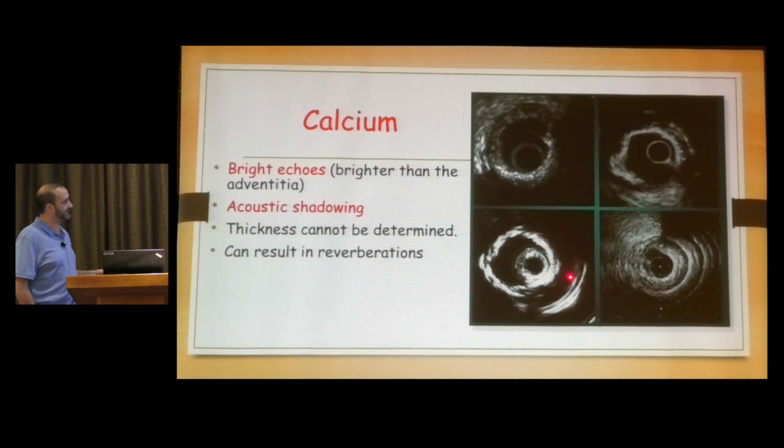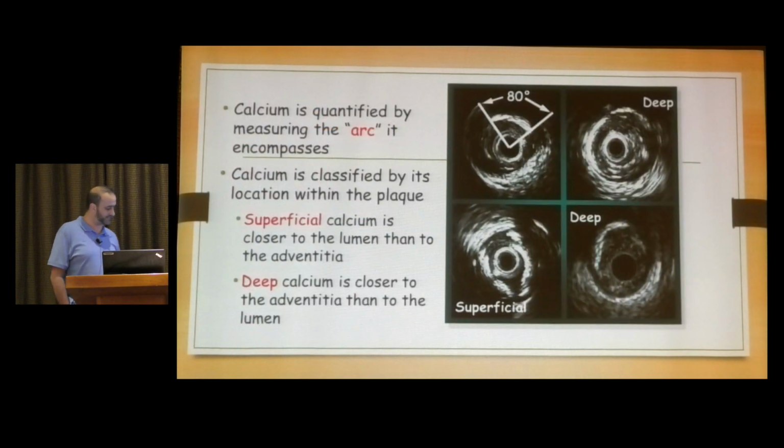This is a calcium. This is a 360 degrees calcium, and behind this calcium, I can't see anything. So we are blind behind that area, and even sometimes we can get reverberation artifacts from calcium.